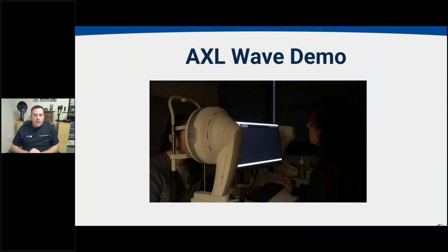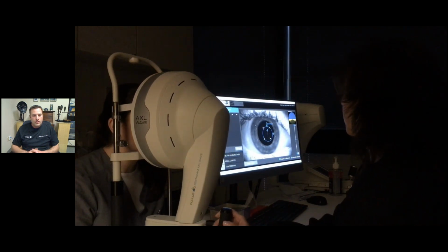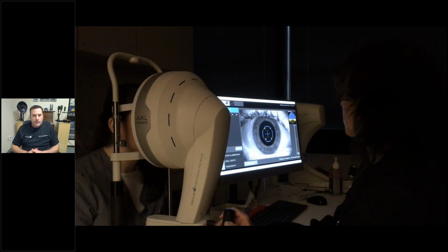So I thought it would be helpful to start with actually our technician. This is one of our optometry interns who agreed to be the faithful subject, but really just kind of run through a video of doing a full sequence scan in real time for one eye. And it's a little disjointed. That's actually the upload. It's not, we did not speed up this video.